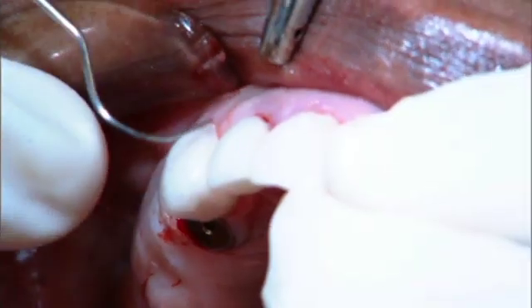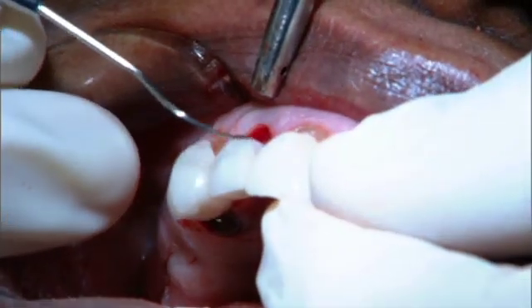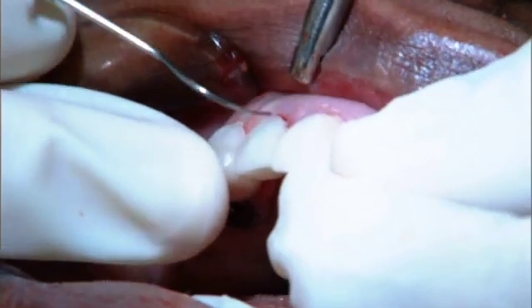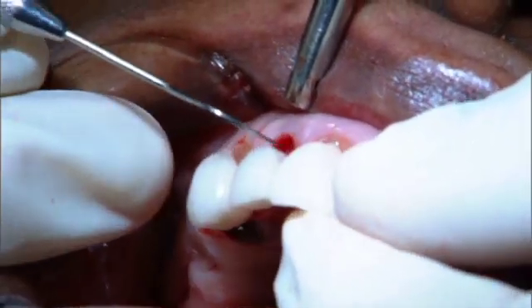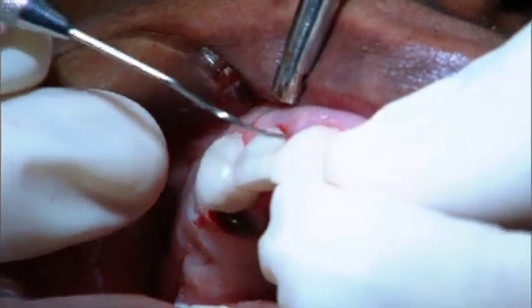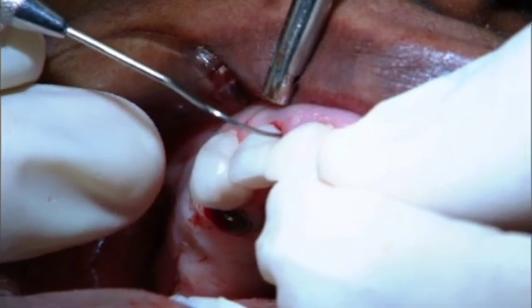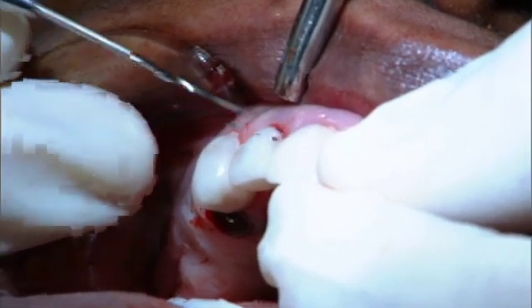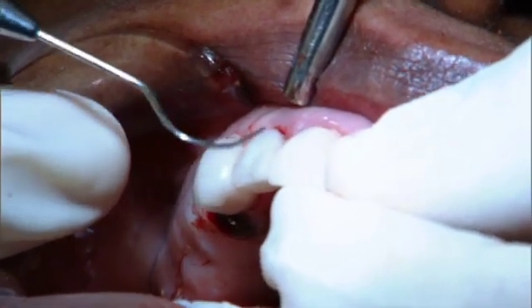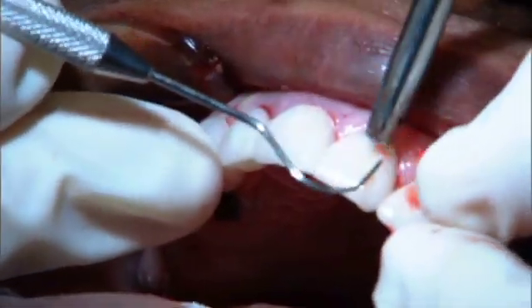Look how the interdental papilla now are going to be sculpted by this pontic and this little projection that we make up into the tissue. That part of the pontic is going to be preserving the soft tissue, the attached gingiva, and the interdental papilla. Now I can add to this, or I can subtract from it to put pressure on either side. This is composite shell on the outside, so I can just add my composite that I have here in the office.